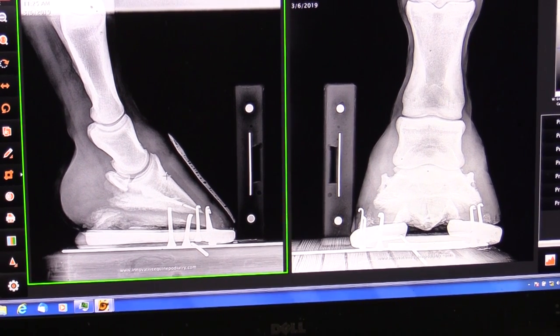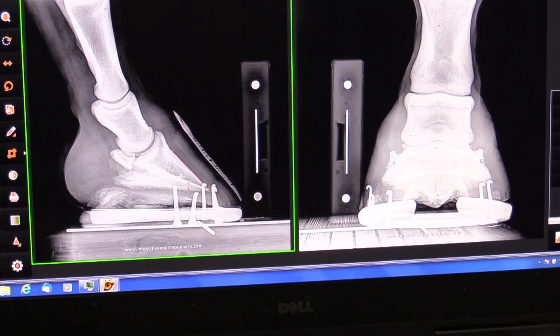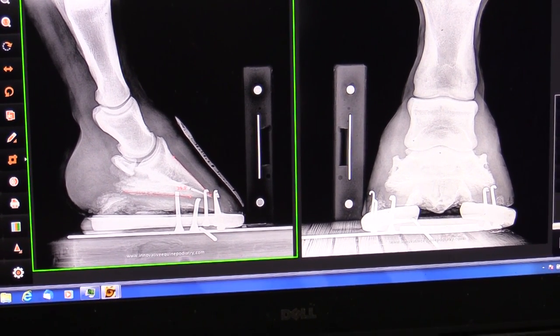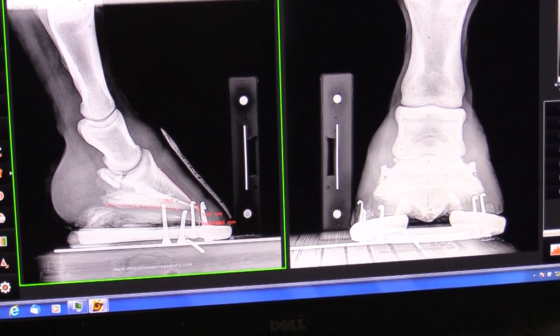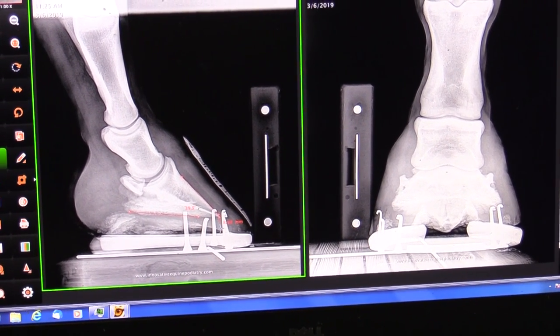Coffin bone is a very similar angle. You'll see a lot of horses that have a 4-degree difference on both sides. This one's 40 degrees or thereabouts, and then one's 42. And we look at sole depth, he's at about 8 or 9 millimeters. I think this horse lost a shoe a couple times, so he's probably lost some foot with that.